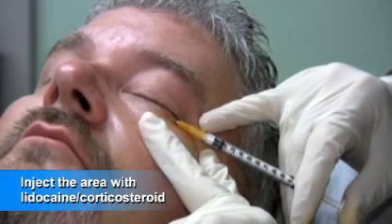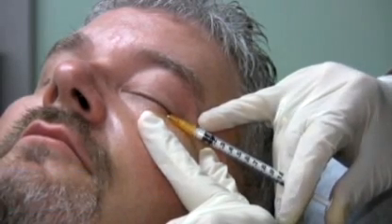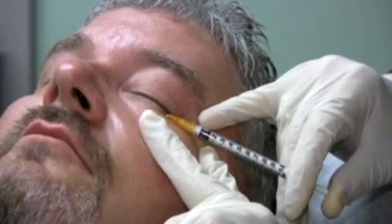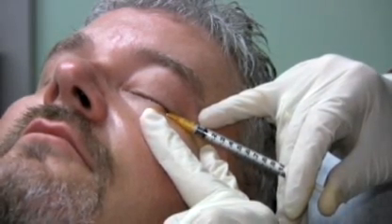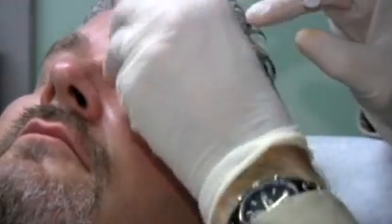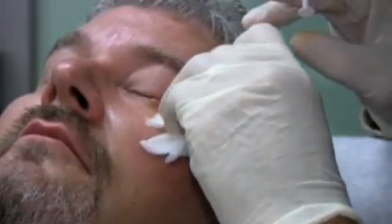Let me make sure I'm definitely in — you can tell because if you wiggle the syringe, it wiggles with it. And here's the injection — and we are done. Good job. Did that hurt a little? Yes. Was the stinging when the needle went in or when the solution went in? Just a little bit when the solution went in. Very good, we're done. Are you okay? Excellent.